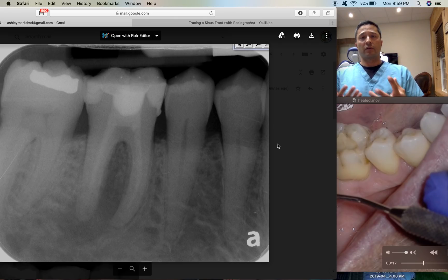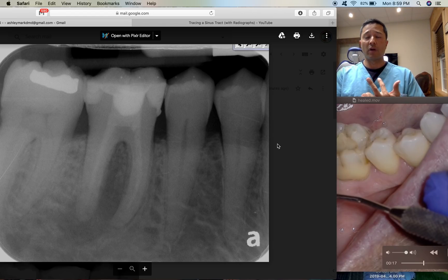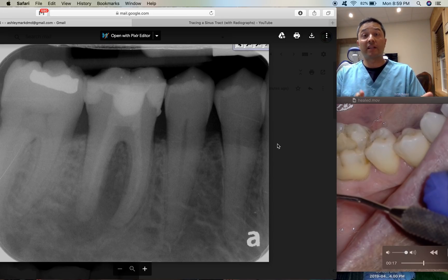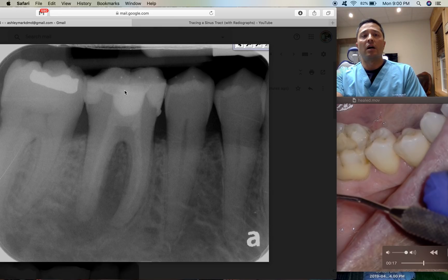When the patient left four weeks ago, we placed calcium hydroxide in the canal. I opened to a primary wave one goal — a 25/07 — to get adequate width for irrigant into the canals and clean everything out. One thing I couldn't do was get the canal to stop seeping. The distal canal just kept weeping clear fluid, and at some point you just have to place calcium hydroxide, because trying to obturate a case that is still seeping is not going to work.